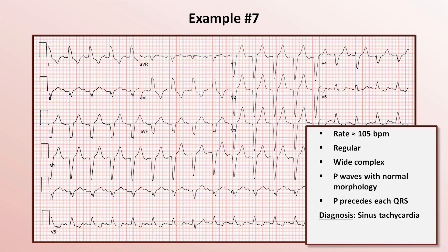Although we are given nothing about the patient's history, the morphology of these complexes is classic for a left bundle branch block. Specifically, there is a broad R wave in leads 1, AVL, and V6, without either a little Q wave or a significant S wave.